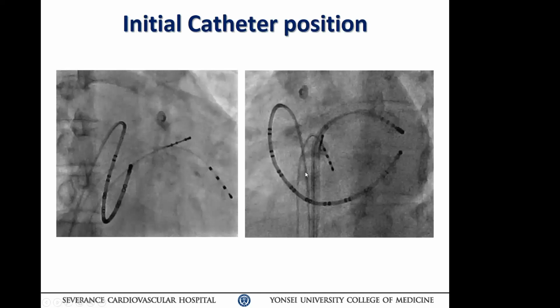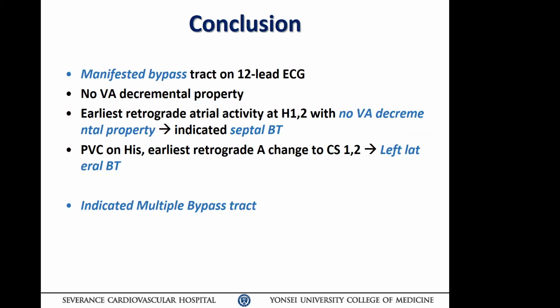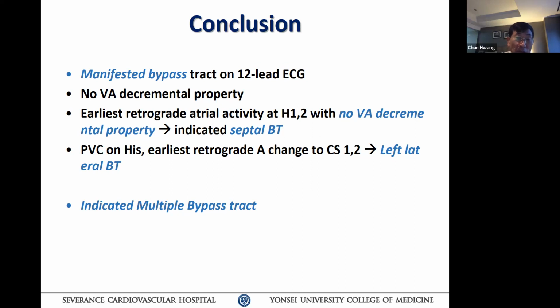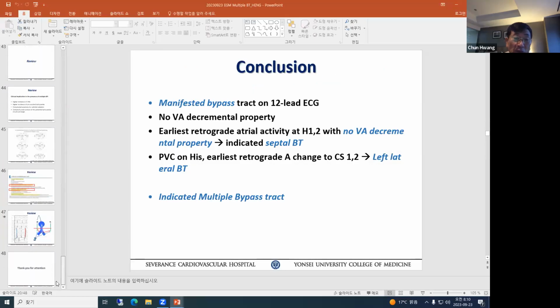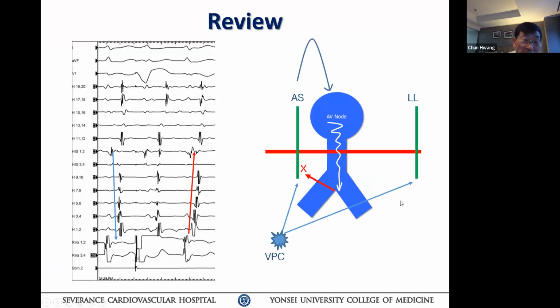Okay, before you do catheter ablation, Hang. Yes, Professor. Go back to your slide. Let's talk about a few things. You had that explanation slide where you think that one pathway is blocked, the other one not. Let's take a look at that. Go back to your slide that Dr. Park was asking about.